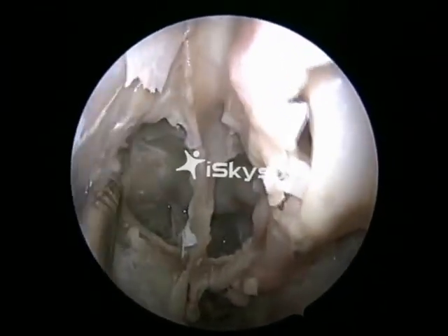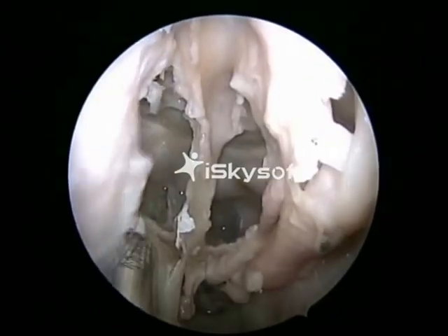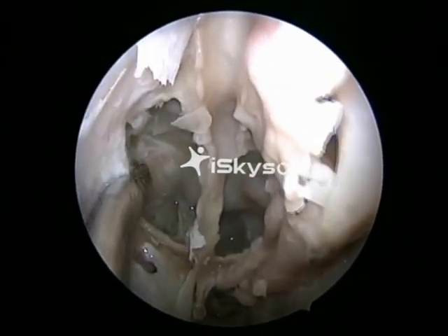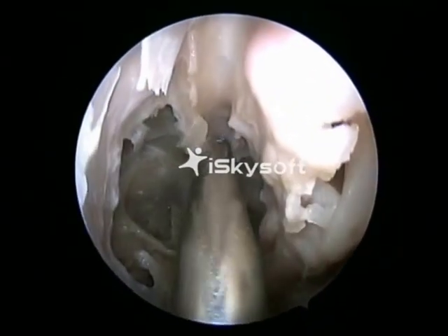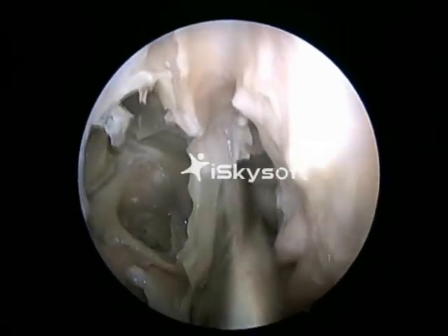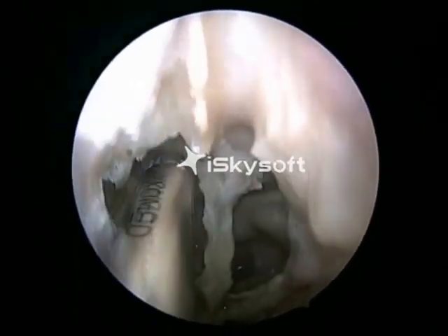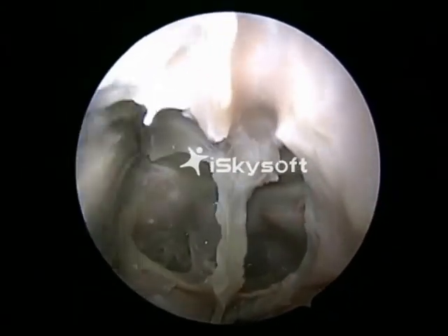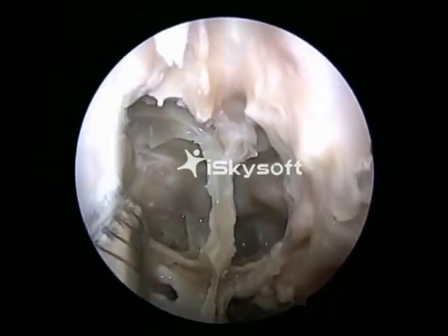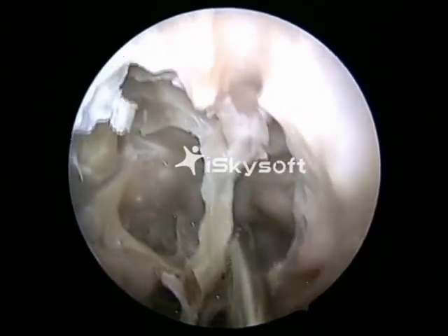A cavity and a half gives maximum exposure to operate on tumors in the sellar, suprasellar region as well as on the clival region. You can see how wide the exposure is right now.